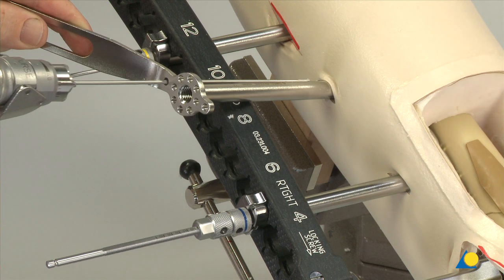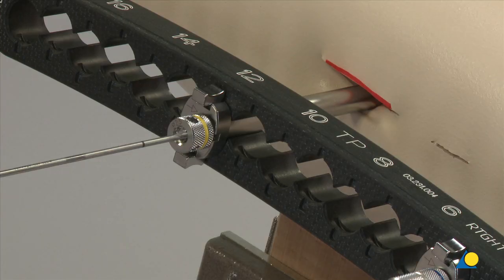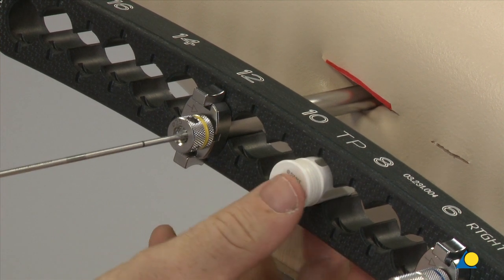Remove the guide wire and the protection sleeve. Mark the screw location in the aiming arm using a stopper.